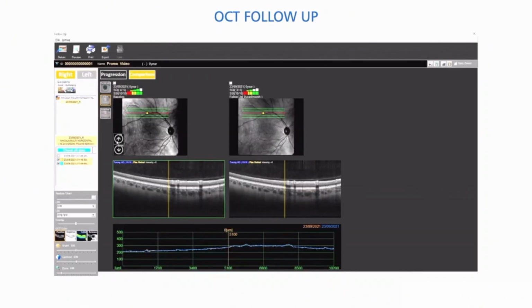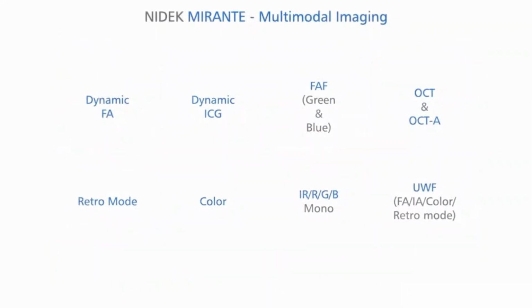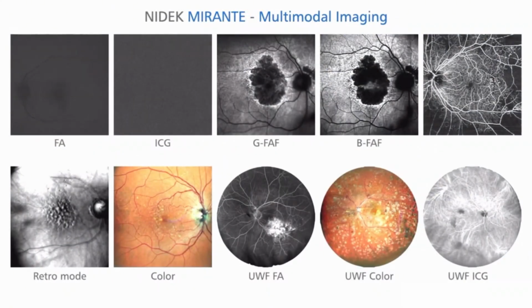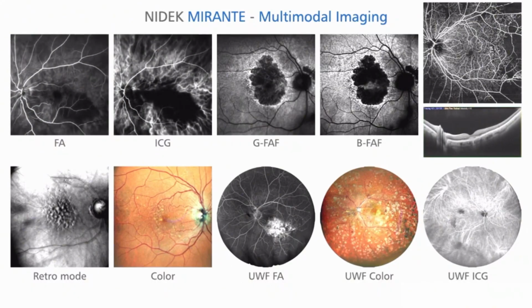It's then extremely easy to compare the baseline and the follow-up examinations one next to the other for maximum accuracy and reproducibility. So this is what you can do with the NIDEK Mirante. All these modalities into one single powerful imaging platform.